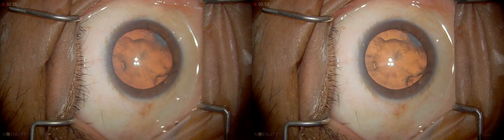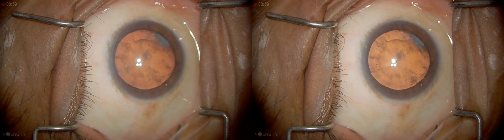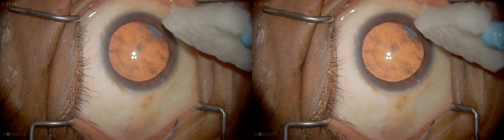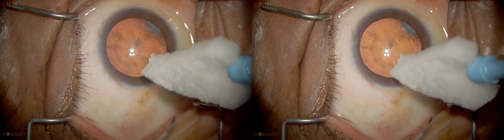We have this gentleman for phacoemulsification. As you can see, there's a little bit of cortical opacity anteriorly with a little fibrosis at that edge. And then there is posterior subcapsular opacification. So this is a reasonably soft cataract.